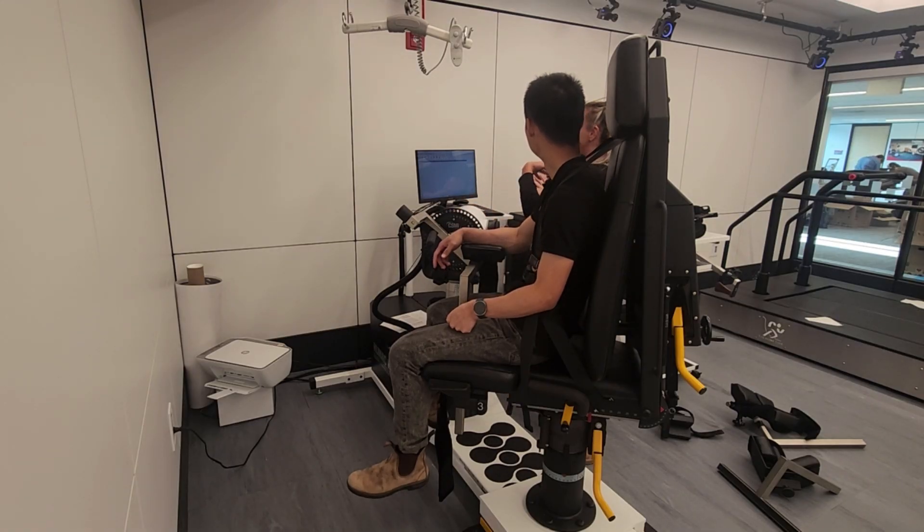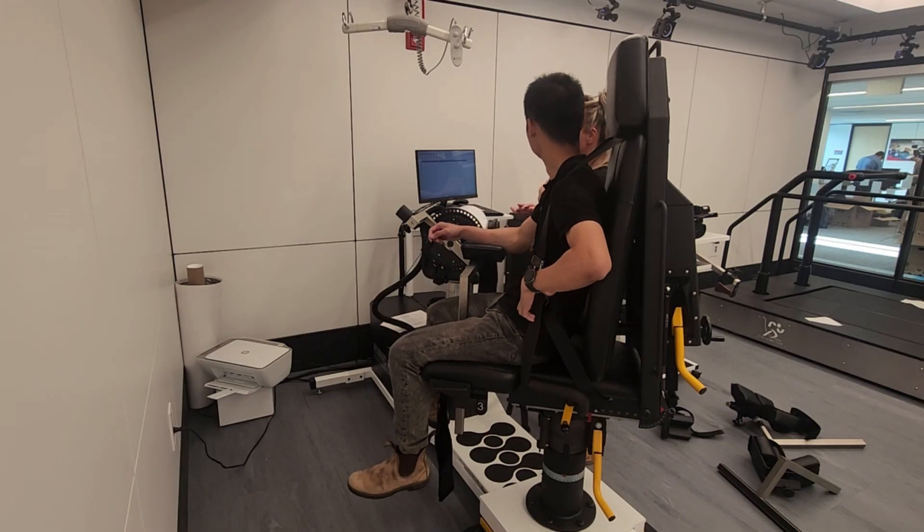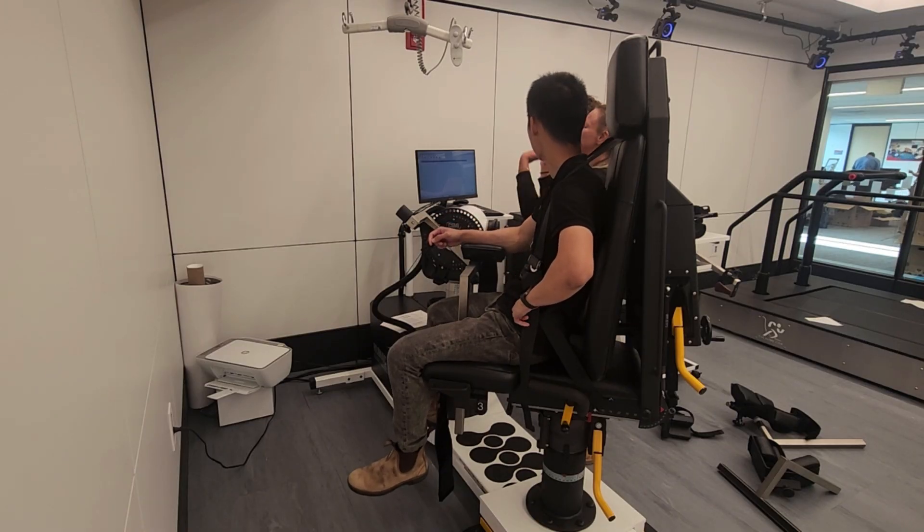What else we can do is we can print them out right away, so people could walk away with a printout if you want. You can give them a fake name — you don't have to put their real name in there. They can come out with their printout — you get the graphs. So if you did left and right, they will put the graph left and right beside each other, so each graph will match. You get torque versus time, and a chart of torques with different types of averages — peak averages, prominence, widths, things like that. A little bit more on the geek side.